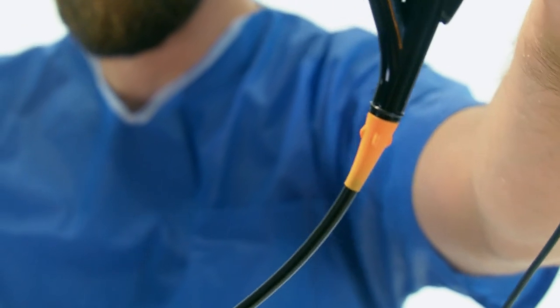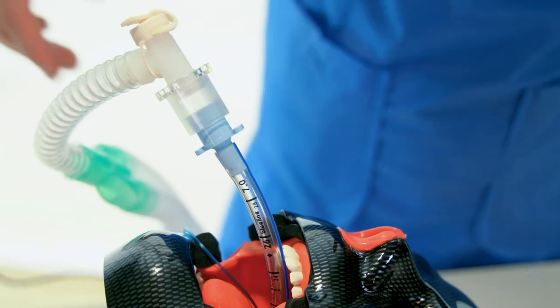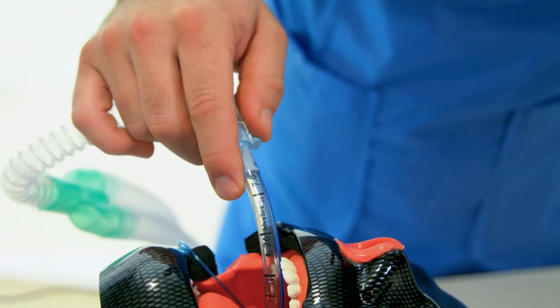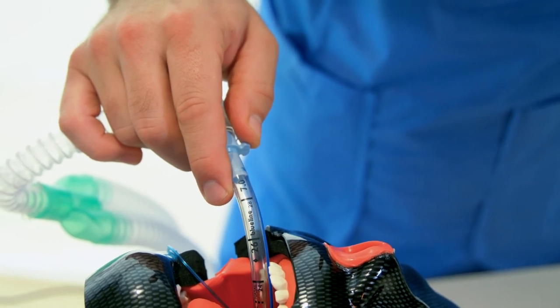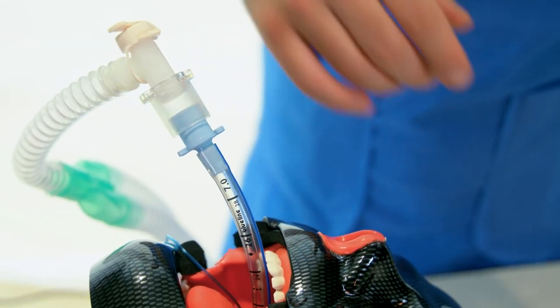BroncoFlex Vortex can fit in endotracheal tubes of 6 mm or larger. Compatibility with the patient's ET tube should always be verified.